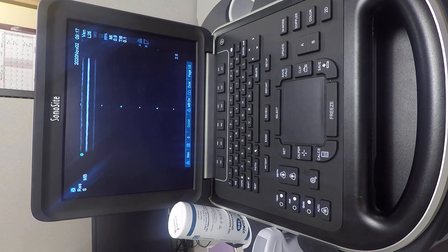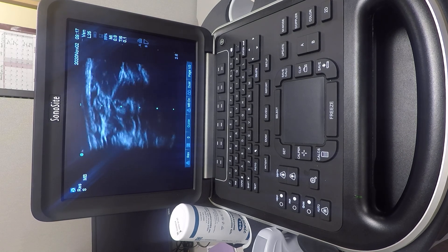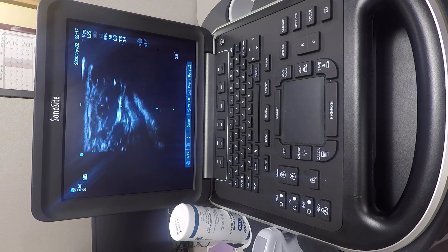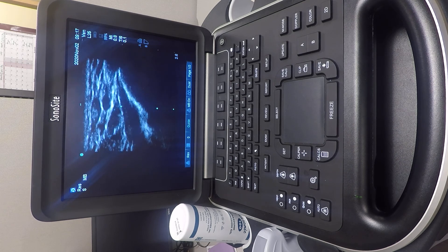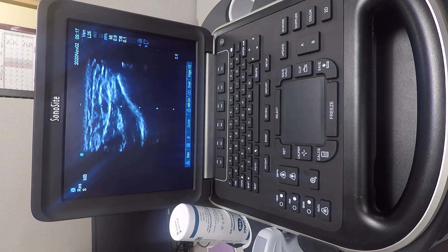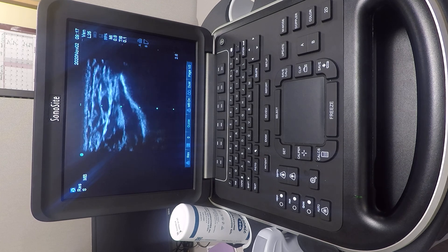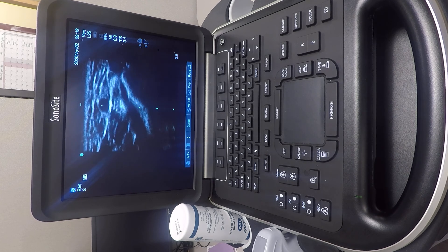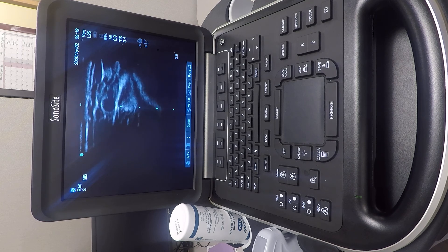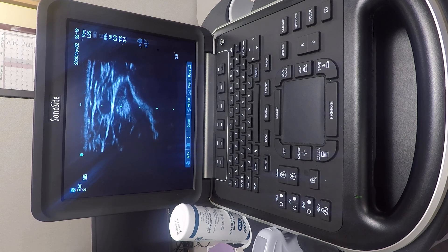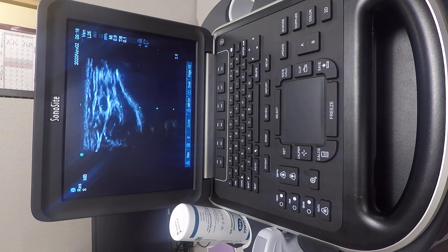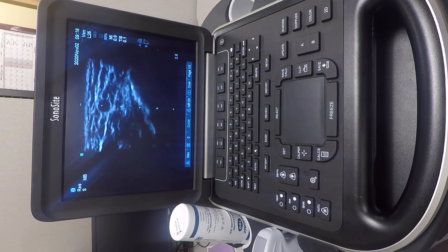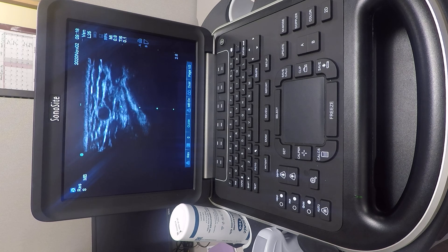First things first, we're trying to find the artery. We can see just below the first green dot the pulsating artery. Vessels are black in the middle because it's fluid. By compressing, you'll see the pulsations of the artery. Right beside the artery is another small circle that's quite compressible.